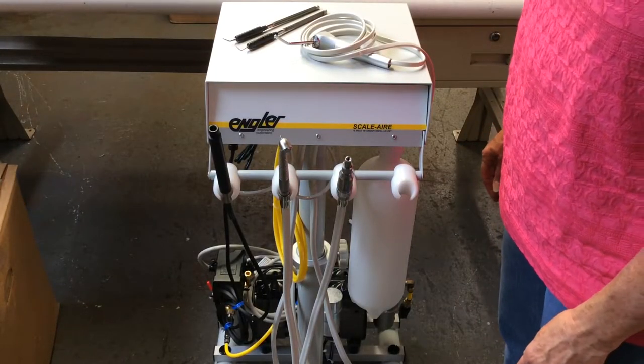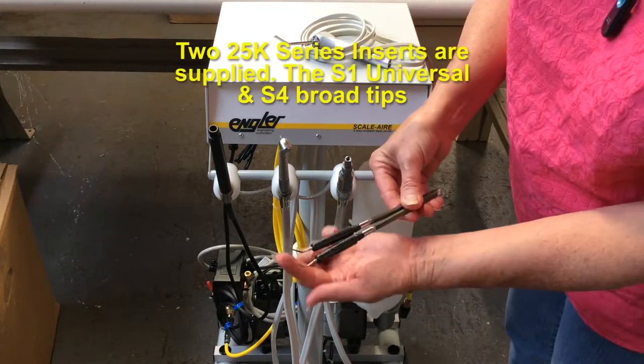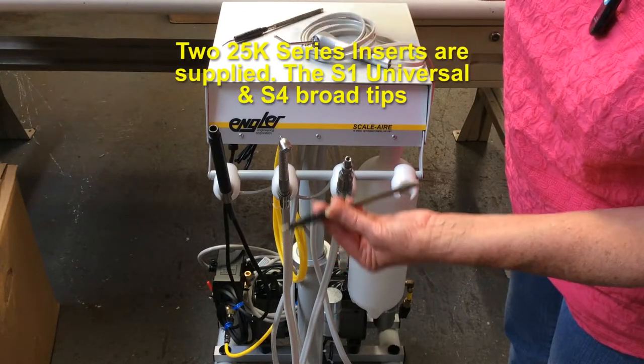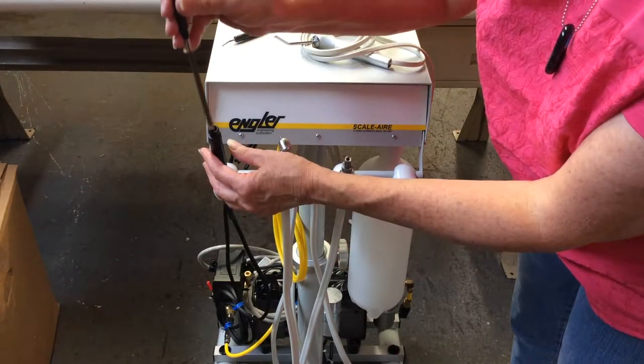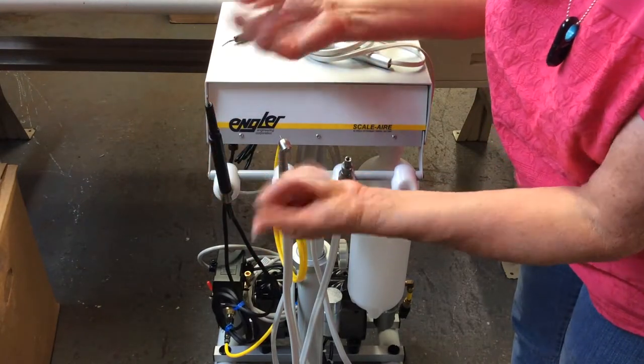The scaling hand piece comes with two inserts — one is pointy and the other is flat. Push the insert into the hand piece all the way down as far as it will go, and you are done.